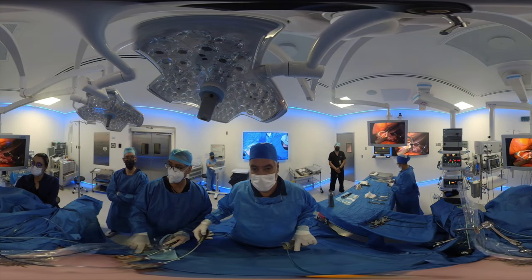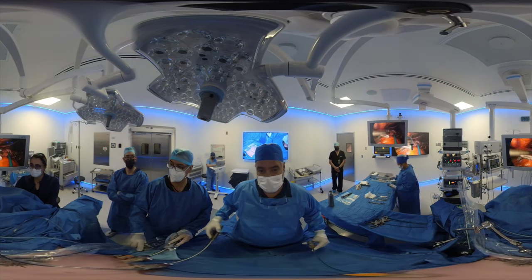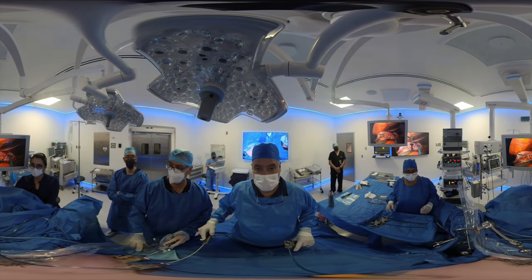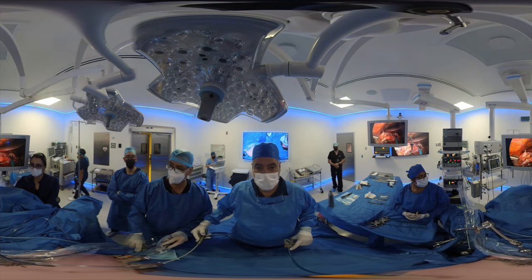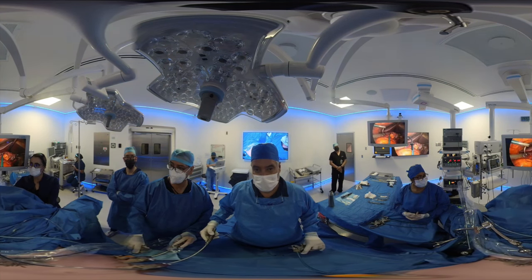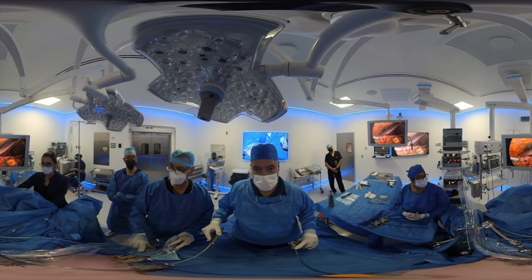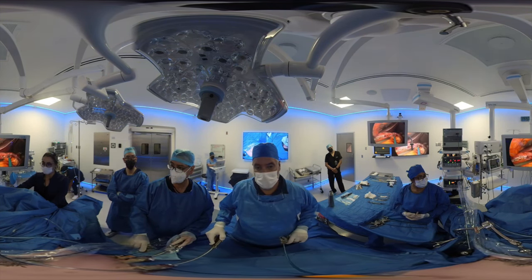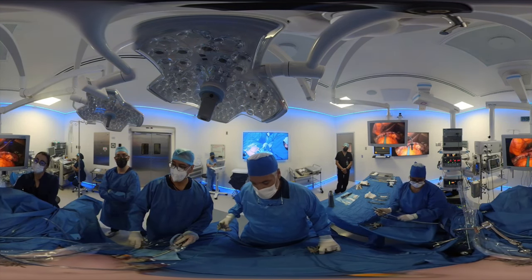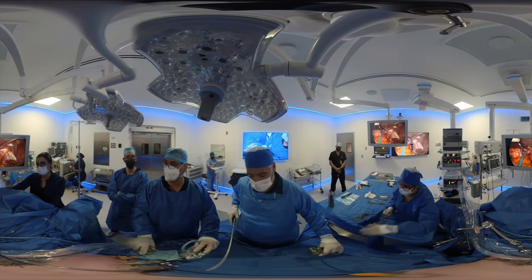If you're interested in surgery, this is a spectacularly quick and effective procedure — minimally invasive. All of this is called keyhole surgery or laparoscopic surgery. We're going to ask anesthesia to remove the tube. As you can see, it's being removed as we speak. I'm going to make this last knot right here and anchor the suture, then reintroduce that tube lightly. I'm going to cut this suture. Now what we're going to do is something called the flat tire test.